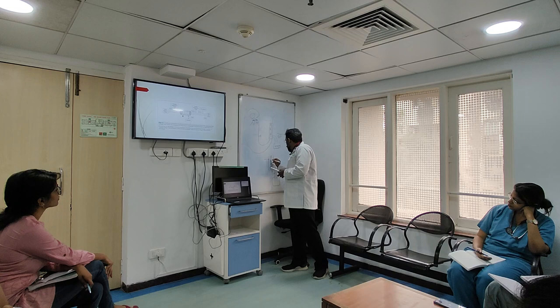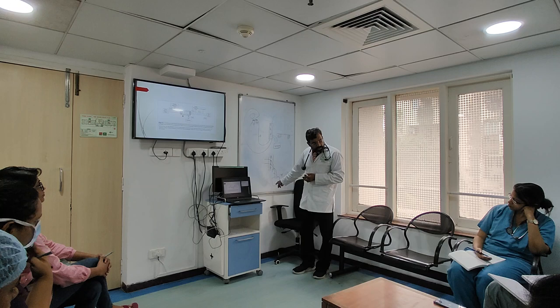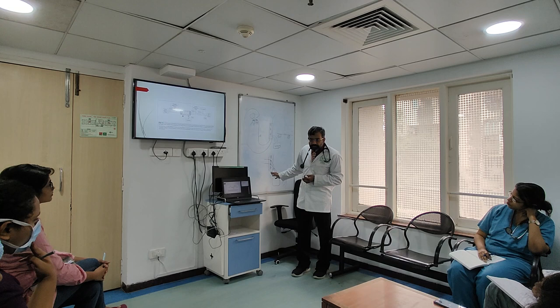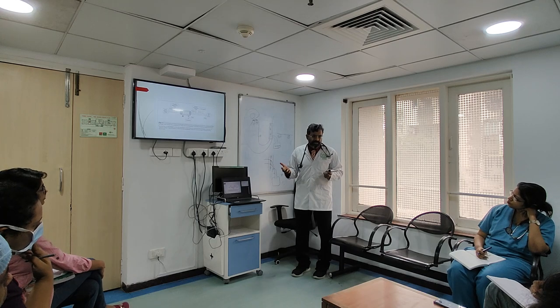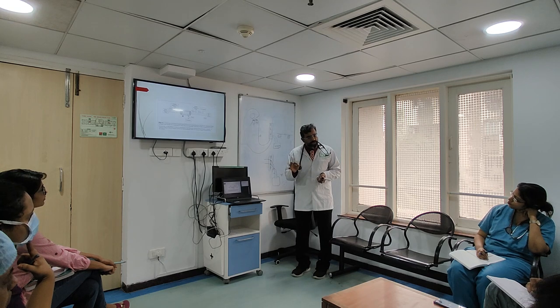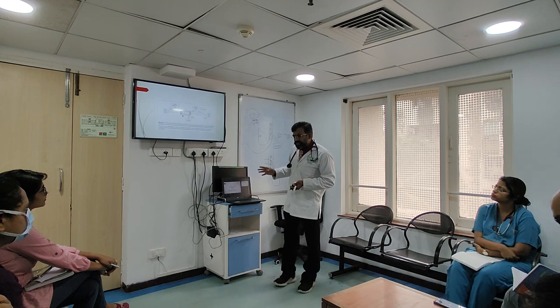The water is moving from the blood, through the semi-permeable membrane pores, to the outside. Can it change the pH? No. It's not going to work for acidosis. Can it change the electrolytes? Again, no. It may cause a little bit of dilution and concentration here and there, but otherwise it is about moving only the water. So nothing more is going to change, only the water. That is why in pulmonary edema, if I want to do fluid removal, this is a very simple method.